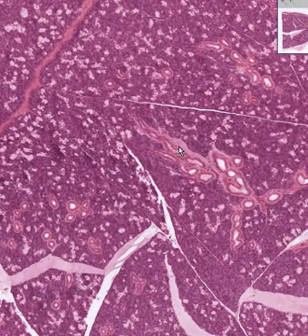I think I've given up on the possibility of intercalated ducts because almost all of these are striated.